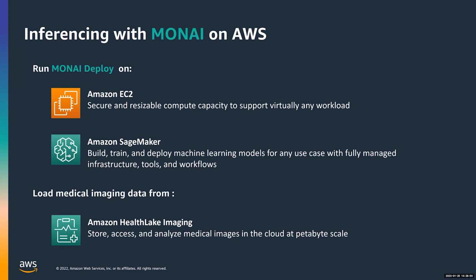If you do that in SageMaker, it's a bit different. And as Vikash and the other intervenant have explained already, you will be using only the MAP. So we have a way to actually use the SageMaker framework itself to load the MAP into it. And from there, you will be using the SageMaker infrastructure to invoke the MAP and get the prediction result. So we'll cover that a bit deeper in the slides.